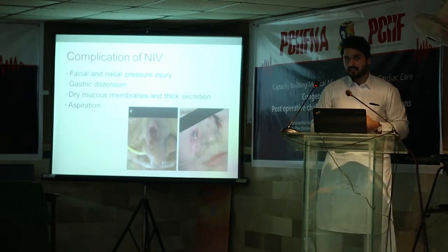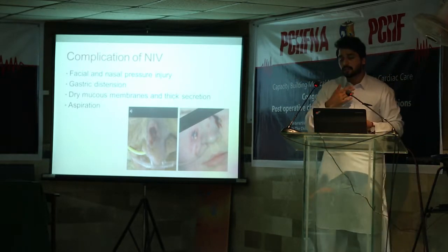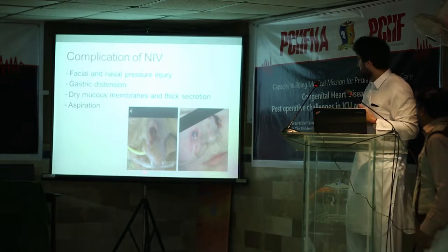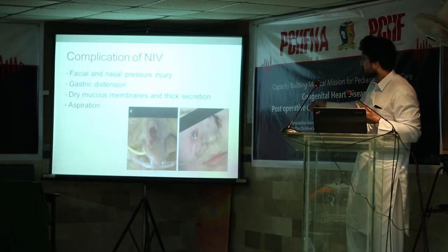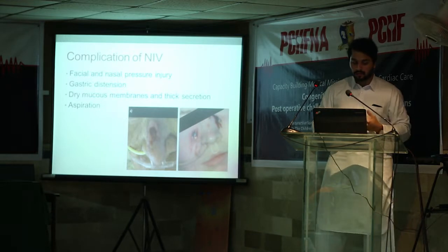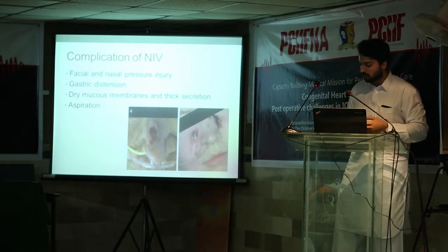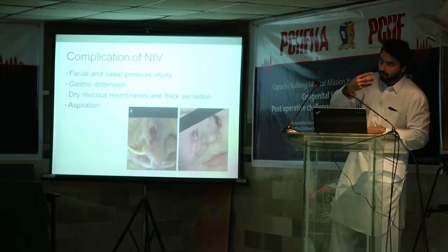For sure, everything has a complication, and these are some complications of the NIV: facial and nasal pressure injury. And we face it a lot in the hospital. So, this is the nasal pressure ulcer, this is a very bad one. This is some gastric distension, because it's a positive pressure, so for sure it will cause some gastric distension. Dry mucous membrane, because it's dry, so we should always put humidification. And aspiration is another complication of NIV, because again, it's a positive pressure, so it could cause gastric distension, vomiting, and aspiration.